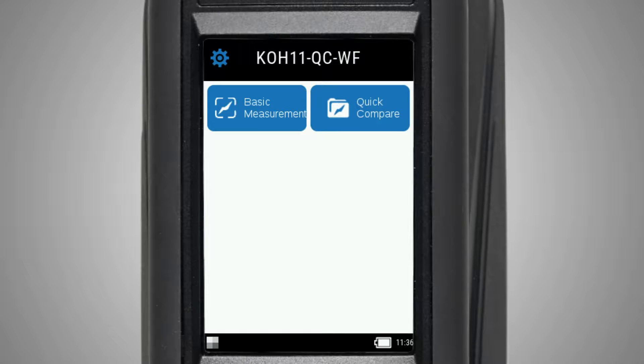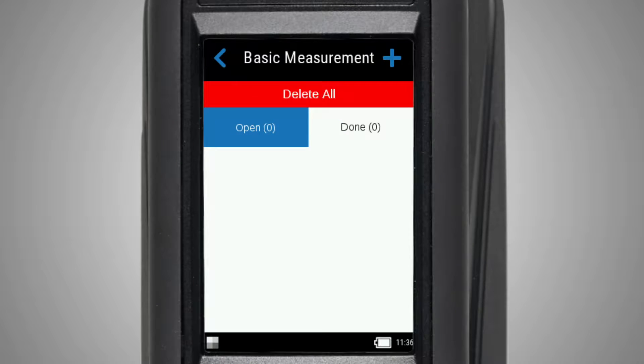The basic measurement icon allows you to take quick measurement readings. To create a new measurement, tap the plus icon.